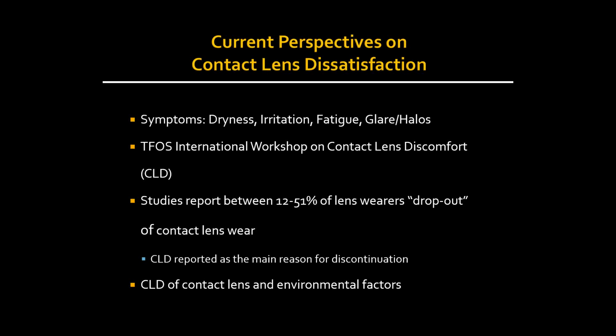So how can we not necessarily prevent this from happening, but are there steps that we can take in order to minimize the effects? I want to first take a look at aspects that contribute to the fit factors, and then the fit factors, in order to determine a good fit, what do we need to look at? We need to look at the environment factors, so the patient factors.